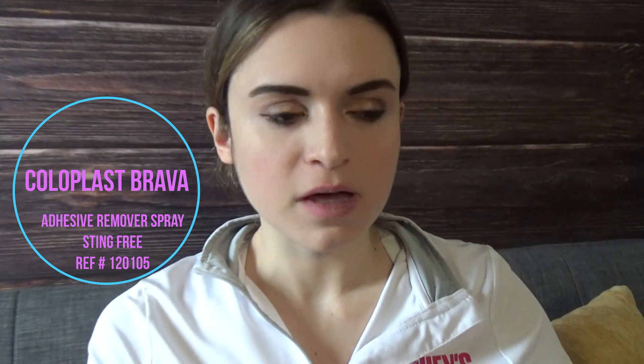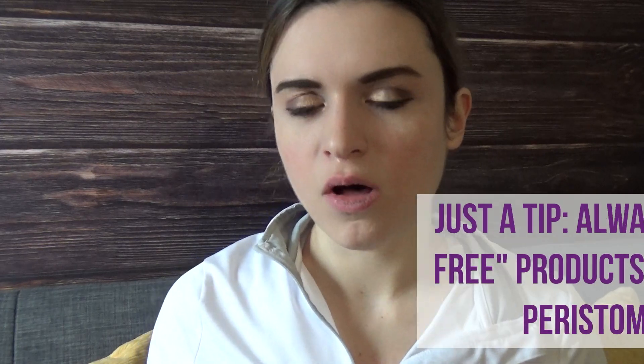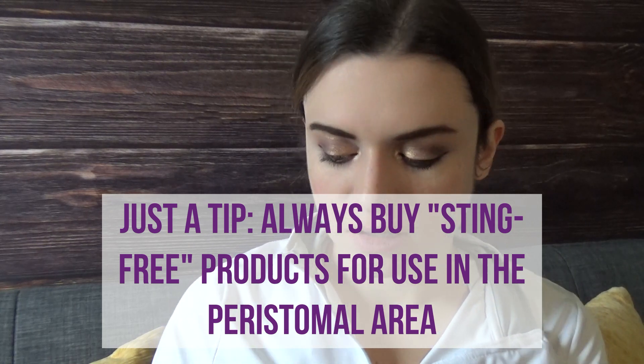The next product is also Coloplast — it's an adhesive remover spray. Hollister also makes one, but this one is my favorite. It's very sting-free, which means for my sensitive skin it doesn't cause that caustic alcohol feeling when you apply it. It takes off Tegaderm, the bag itself, and the barrier ring really well.